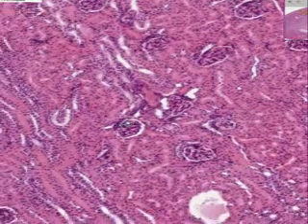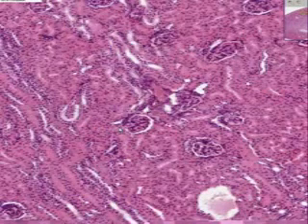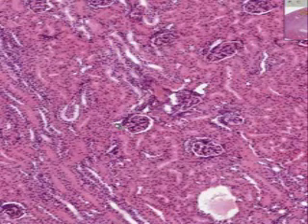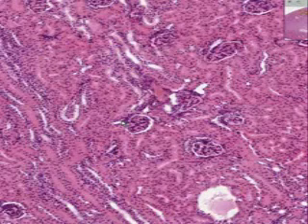Often, if you're lucky, in the vascular pole, you may be lucky enough to see structures that have a lumen, and that would be the portion of the distal convoluted tubule which comes in proximity to the vascular pole to form the so-called juxtaglomerular apparatus. And I'm not going to take you any further than that.